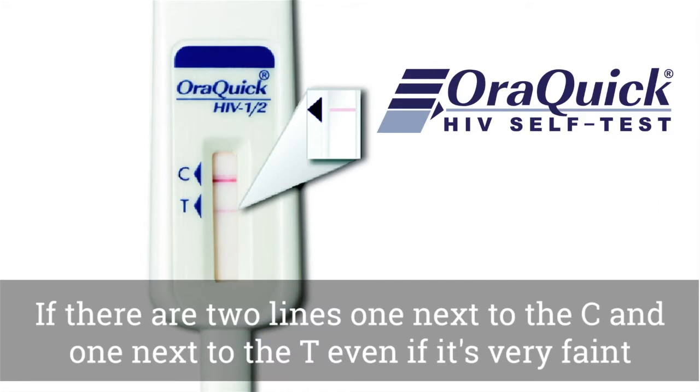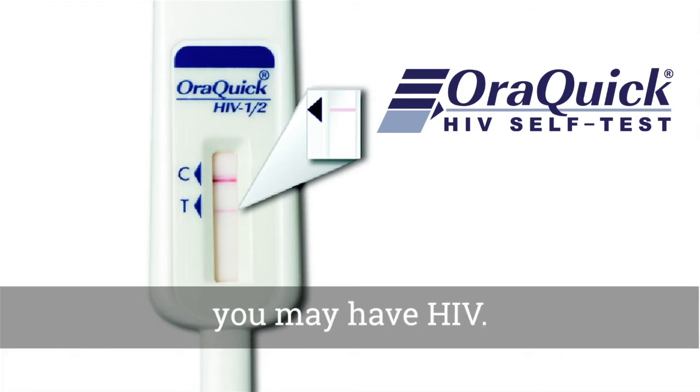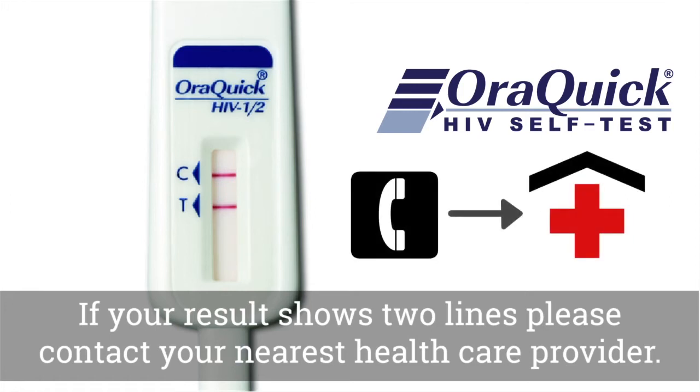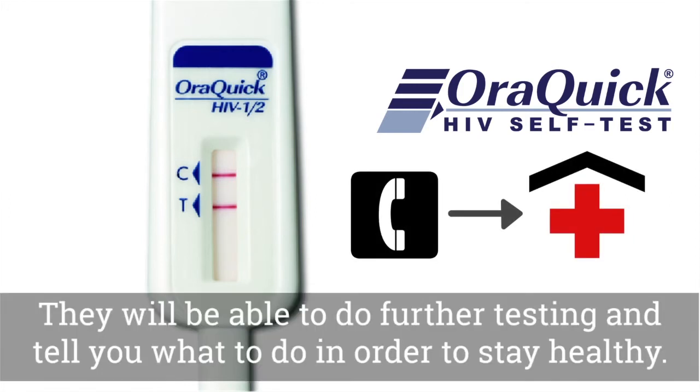If there are two lines — one next to the C and one next to the T — even if it's very faint, you may have HIV. If your result shows two lines, please contact your nearest healthcare provider. They will be able to do further testing and tell you what to do in order to stay healthy.